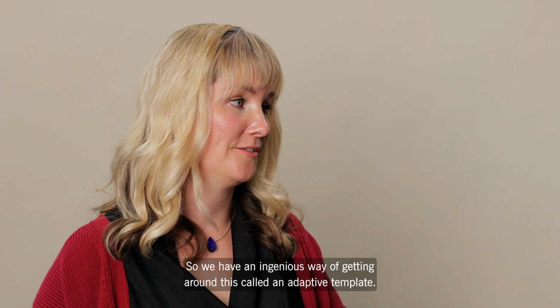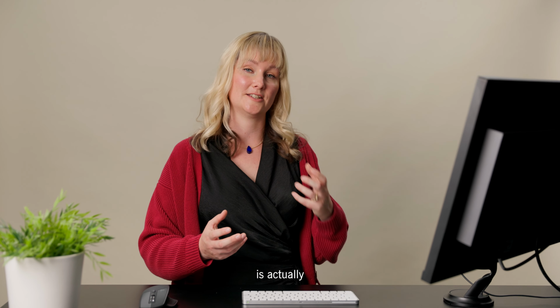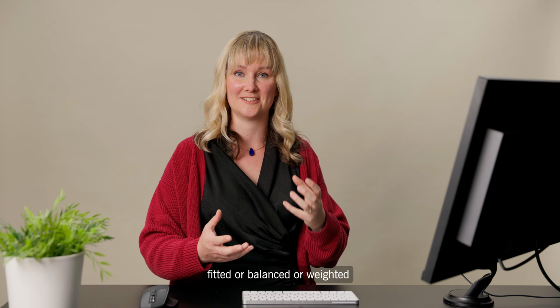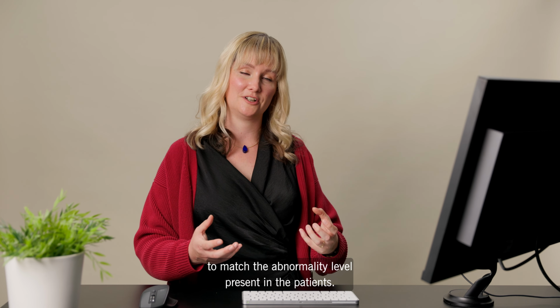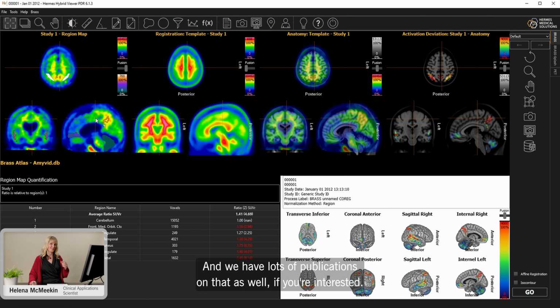So we have an ingenious way of getting around this called an adaptive template. The template that's used is actually fitted or balanced or weighted to match the abnormality level present in the patient. We also have normal templates for the 3 PET amyloid tracers, Amyvid, flutemetamol, and florbetaben. This is an example of the Amyvid tracer. We have a really innovative algorithm which uses an adaptive template to make sure that the registration is not affected by the level of abnormality in the patient scan. And we have lots of publications on that as well, if you're interested.